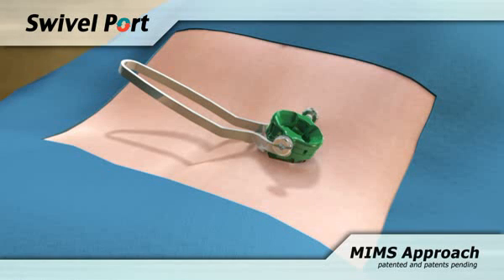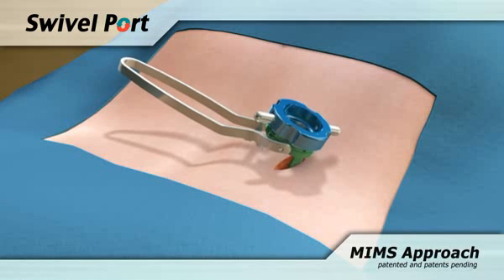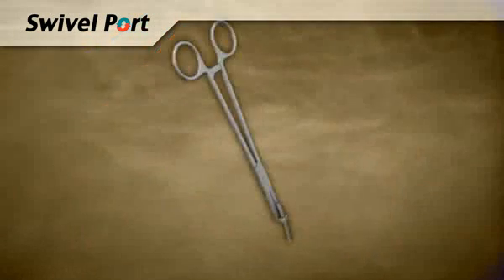With the fusion complete, close the expander blades by first loosening the screws, then remove the expanding blades. Reattach the rotating ring and turn the ring counter-clockwise to close the swivel port base. Remove the swivel port base from the wound and close the tissue layers in a standard manner.